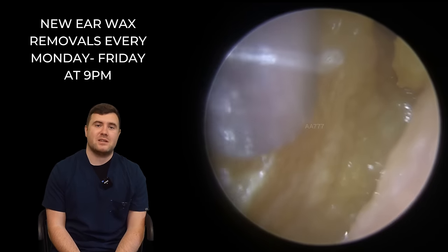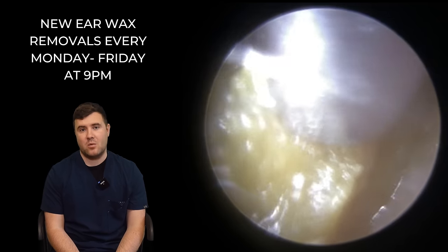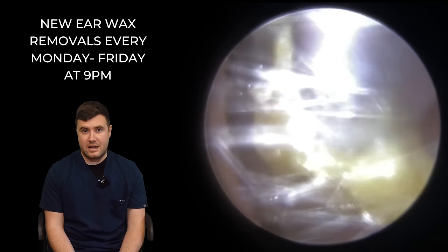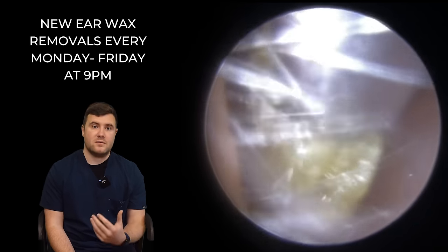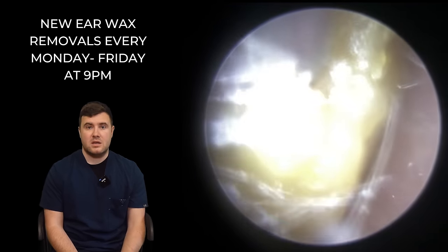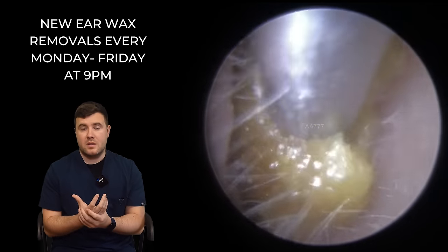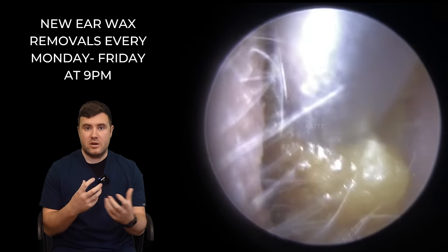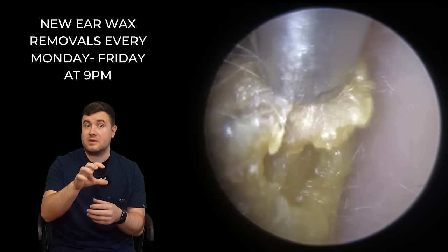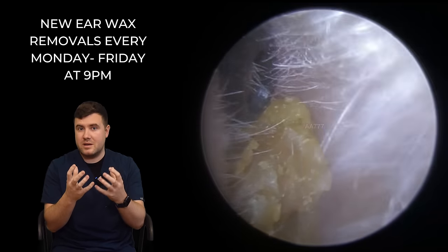So you can see this particular patient has come to see me, really, really blocked up in both ears. It's been in there for a little while as well — she's been struggling for quite a while. What we've got in these ear canals, in both ear canals, is a mixture of dead skin and wax. This lighter material at the entrance is where we've got this casing of dead skin, which is almost quite brittle — meaning it's quite dry. You can see we're actually struggling to get a suction grip on this piece of wax; it just breaks away in little pieces.